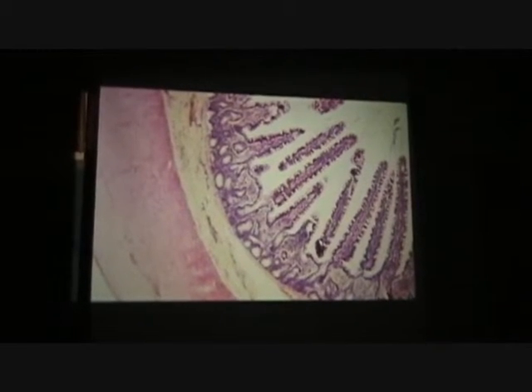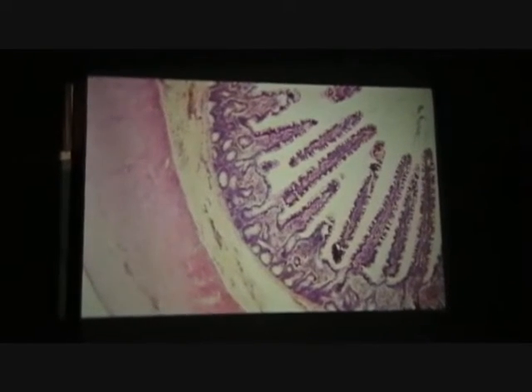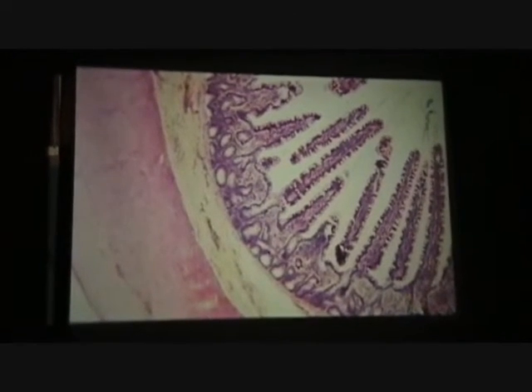Actually picking up on the chainsaw look for villi because of all the goblet cells. It's actually from ileum because of the profusion of goblet cells. Duodenum and jejunum, they're just starting to get more numerous. But here, it's just identify the dominant structure to tell you what compartment it's from. All right? Try another.